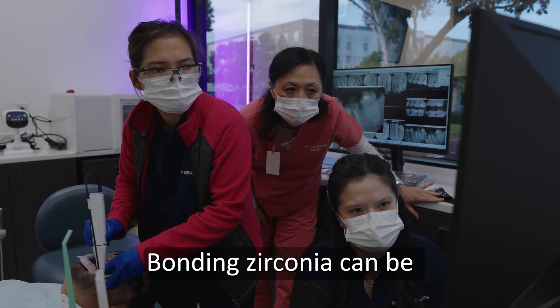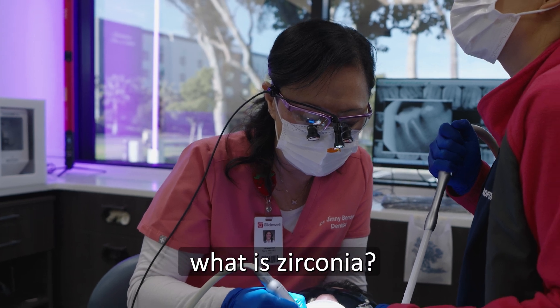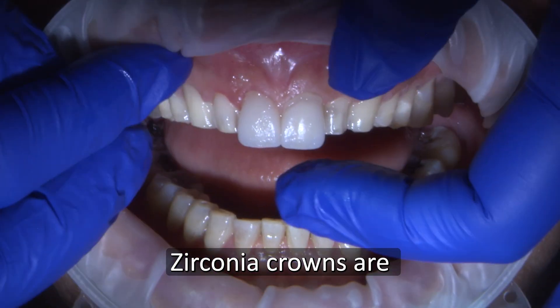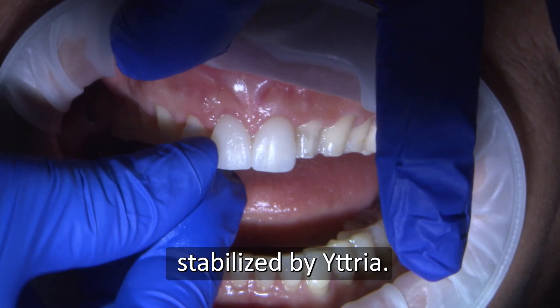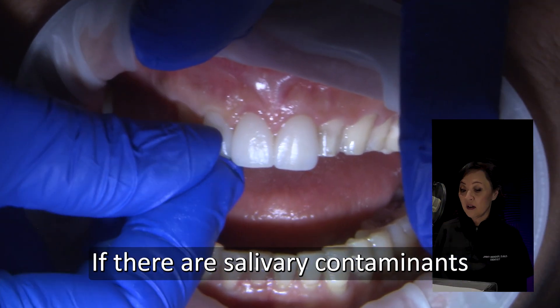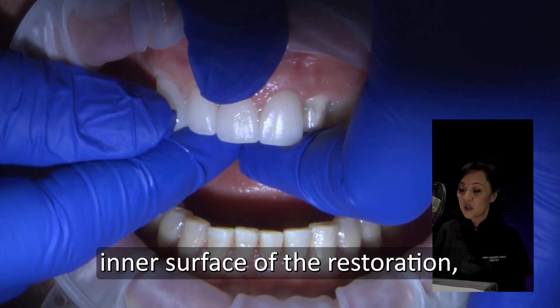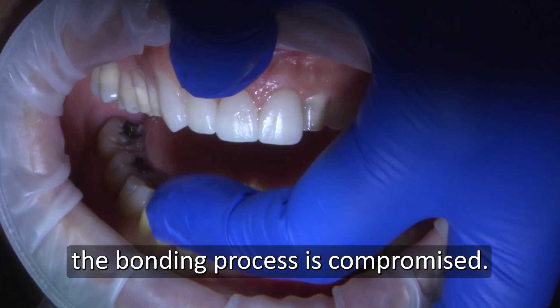Bonding zirconia can be confusing for some, so let's find out what zirconia is and what the bonding protocol involves. Zirconia crowns are made of zirconium dioxide stabilized by yttria. If there are salivary contaminants on the intaglio inner surface of the restoration, the bonding process is compromised.